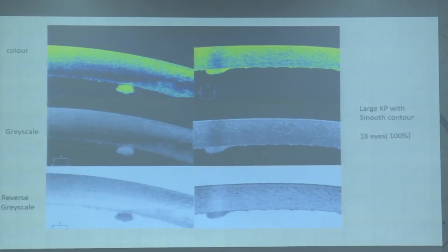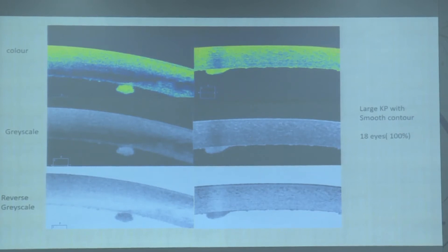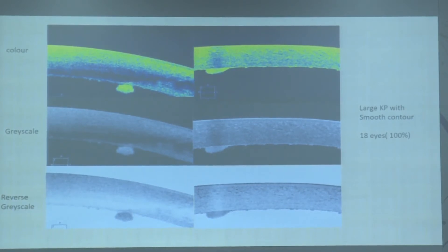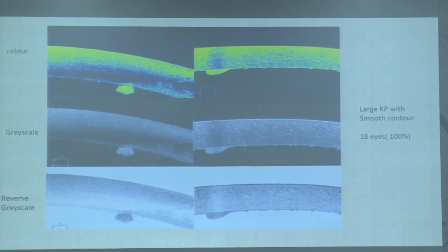The bottom picture shows typical intraocular lymphoma KPs which are large and white in color. Note carefully the intervening area between the KPs — they are not regular, having an intervening spider web-like pattern. The first ASOCT finding was morphology: KPs were large and smooth, seen on color, grayscale, and reverse grayscale maps.